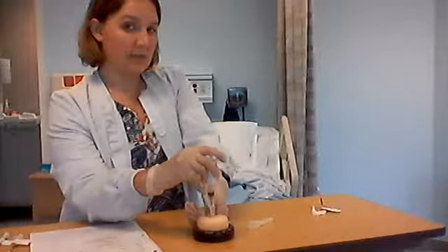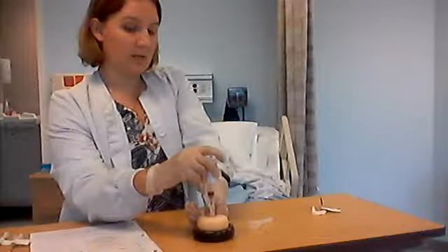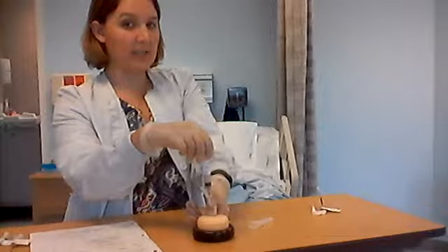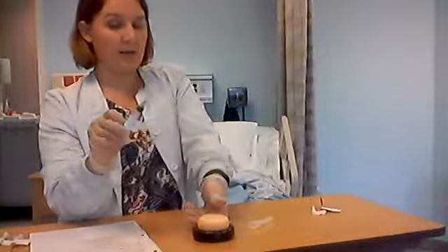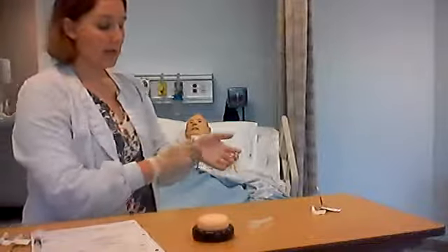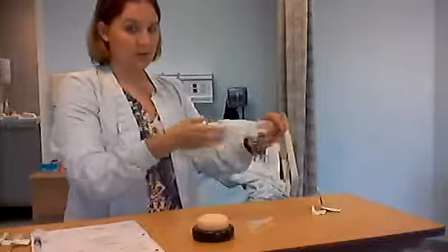Wait 10 seconds. And then as I pull my needle out, I'm going to release with my other hand. And then this safety locks and goes into the sharps. Again, do not recap the dirty needle. We're going to instruct our patient, don't massage it, don't touch it, leave it alone. If he has issues, to go ahead and put the call light on and let us know. Okay? So how are we doing, Mr. Walker? Mr. Walker's doing good. He's in a safe position. I'm going to take my gloves off, wash my hands, and go back out to chart.